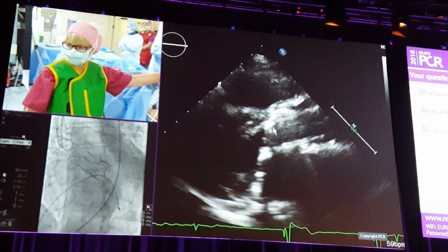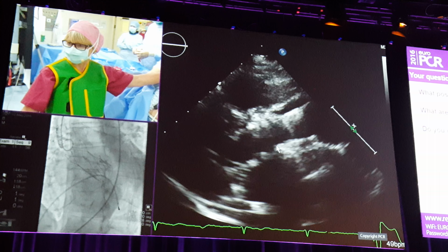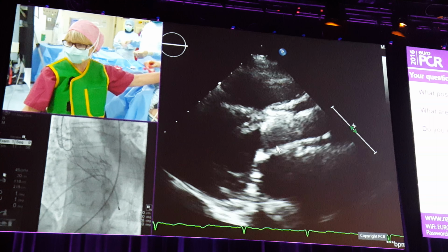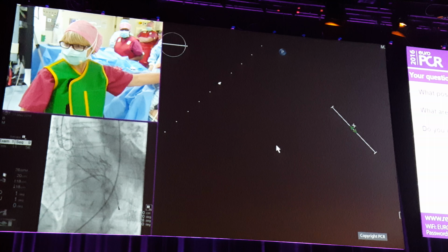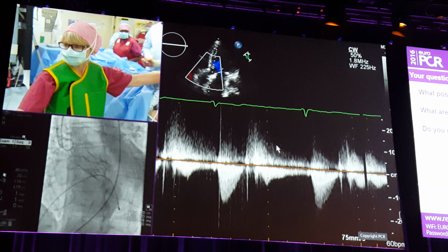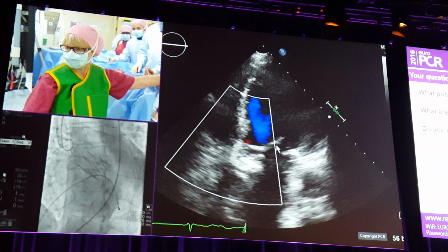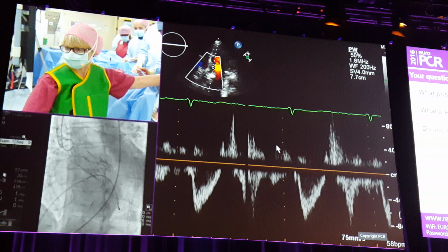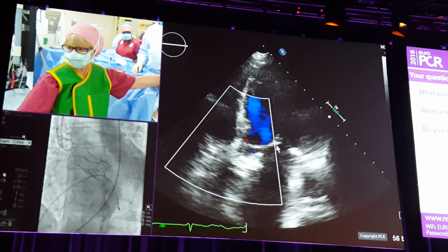Whereas the annulus is right down here. And there's only trivial paravalvular regurgitation, which I can't even appreciate on this view, but I was able to see on the apical view. And I haven't done the measurement, so there you go. In fact, you can't even see it there, there's trivial aortic regurgitation, hardly any at all.